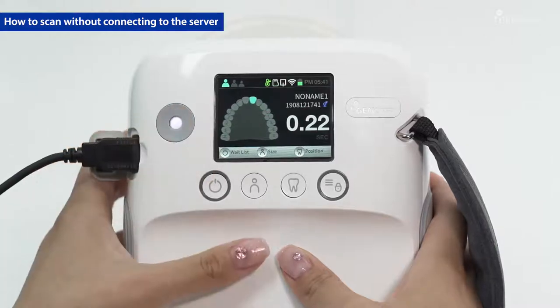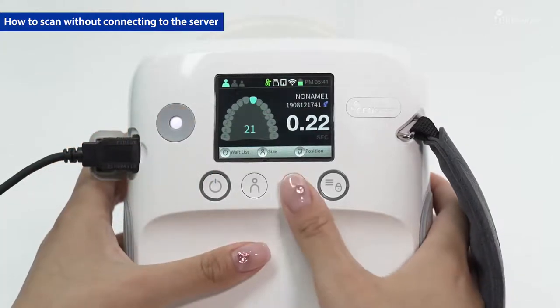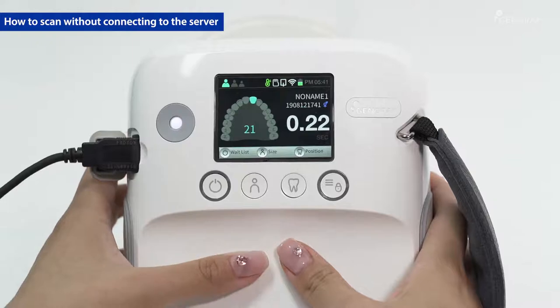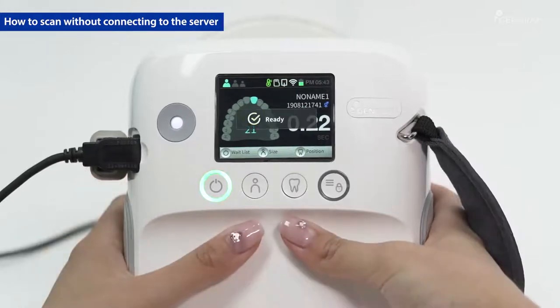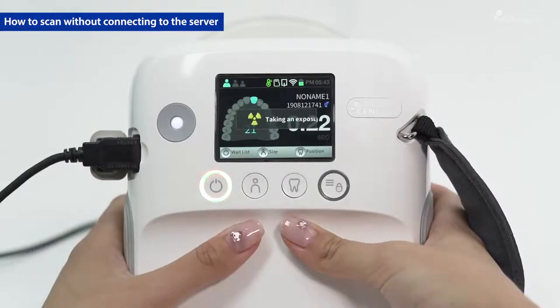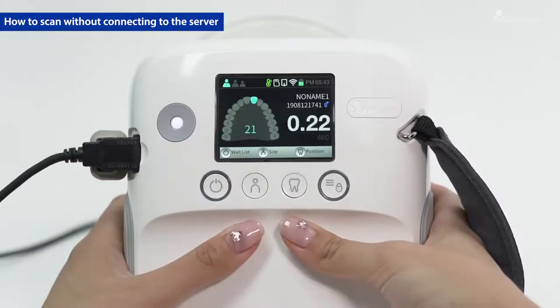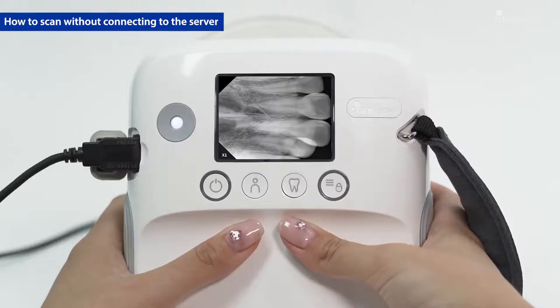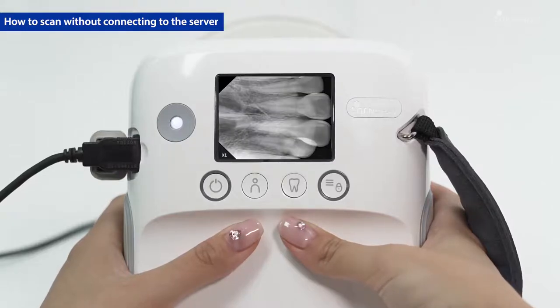Position the beam limiting device of the equipment exactly where to expose and press the X-ray button for exposure. Review the images directly on the LCD screen after the scan is finished.